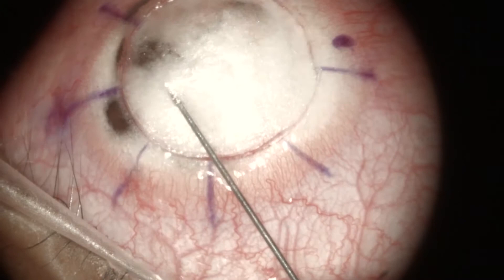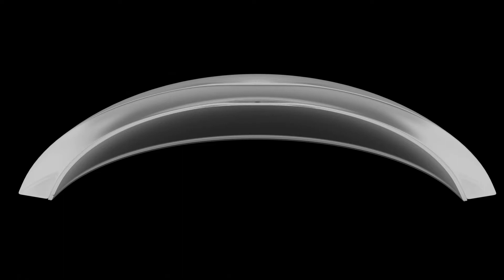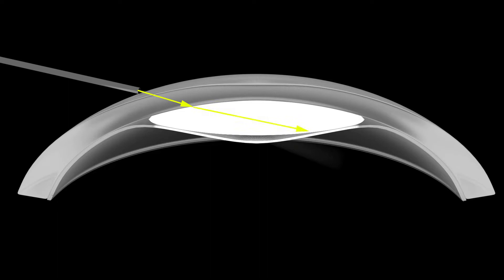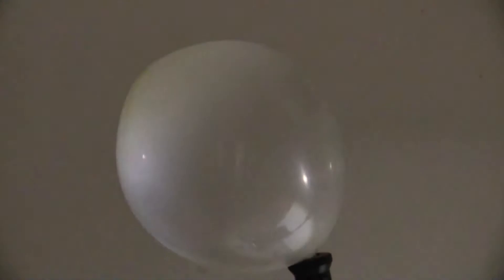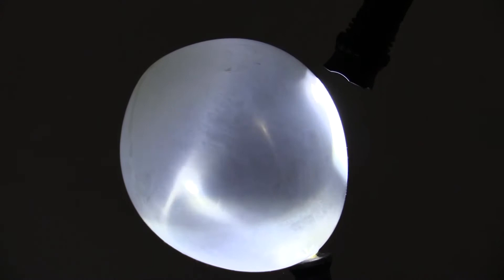To solve this problem we will describe a technique we have been using since 2010 that we named corneal transillumination. The basic principle is the light reflection over the internal borders of the air bubble. After injecting the air, as we see in this animation, the probe rests over the cornea reflecting the light on the internal borders of the air bubble walls. This simple experiment performed with a balloon and a flashlight shows how the light is reflected over the interior wall of the balloon, creating a spot on the opposite side of the light source.